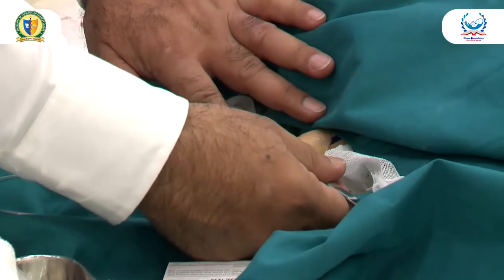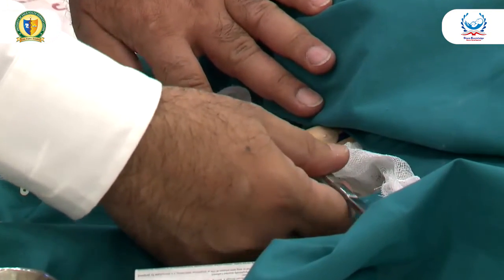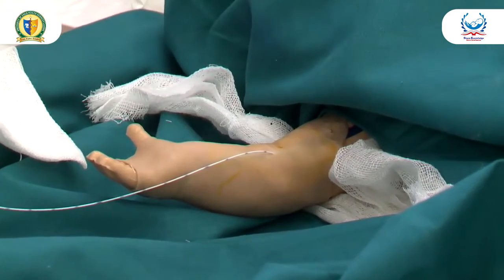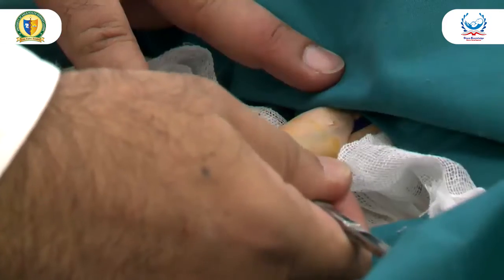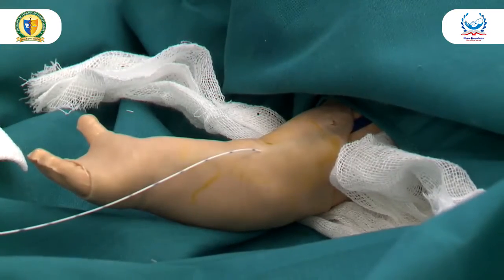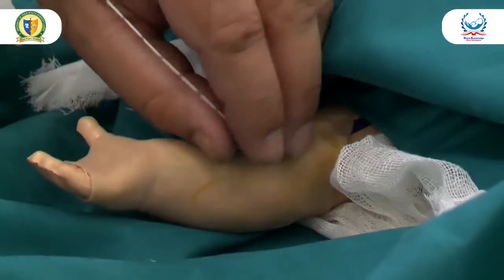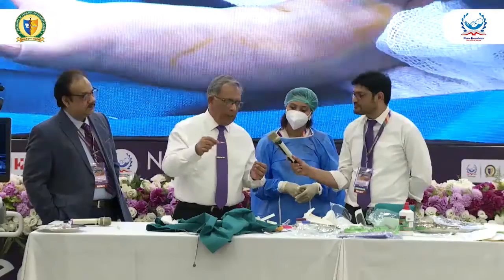आप अब यूं नहीं कर सकते अंदर push. वो needle के through ही push कर सकते हैं. अब 14 का advantage ये है कि if it is a little bit in the heart, then you can just pull it out, same centimeter, and then fix it. One, this is a 20 centimeter long. मैं इसको निकाल लेता हूँ.